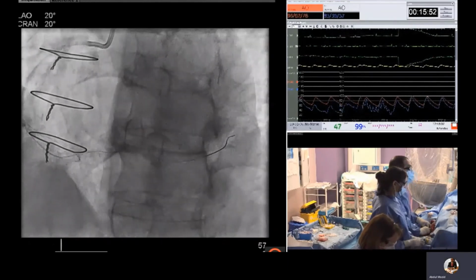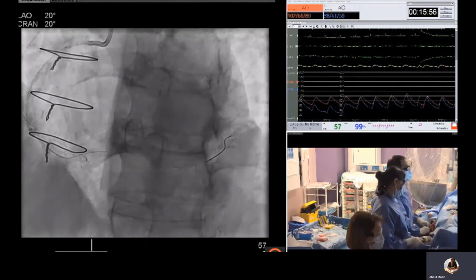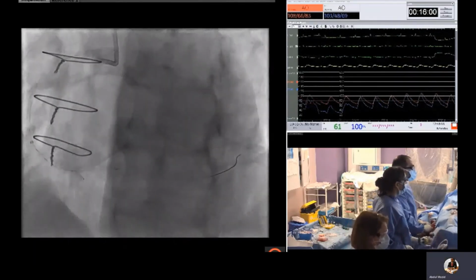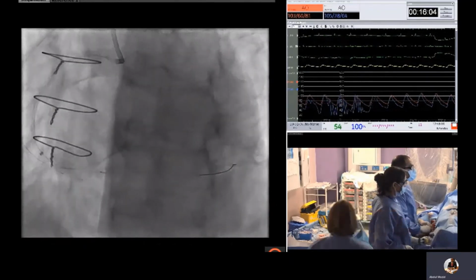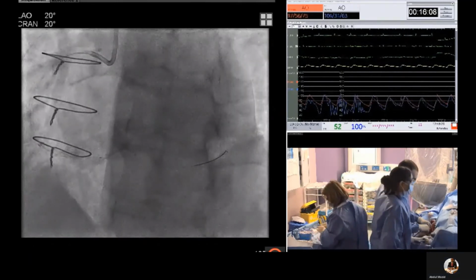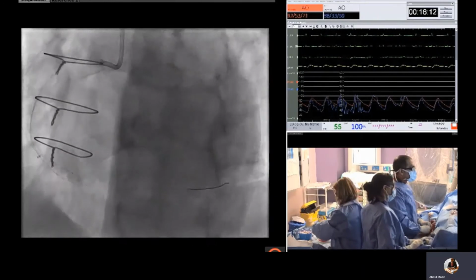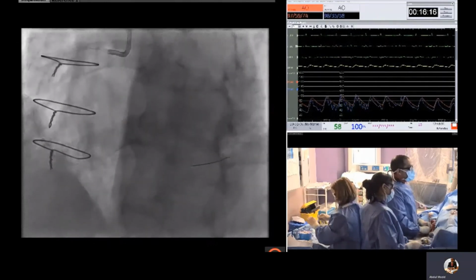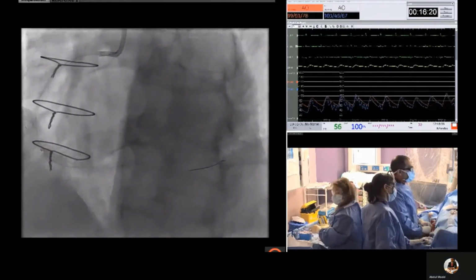You can see here, despite pushing with the guide extension catheter, this is as far as the 1 millimeter balloon would pass, and you can see the guiding catheter being pushed back. So this is somewhat surprising, as usually if a microcatheter is able to cross, a 1 millimeter balloon will usually follow.